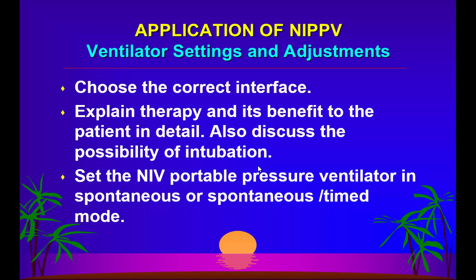So first I will talk about the ventilator setting and then how to initiate it. The first thing is to choose the correct interface. The correct interface most of the time would be an orofacial mask, which covers the mouth and the nose so that there is no air leak.